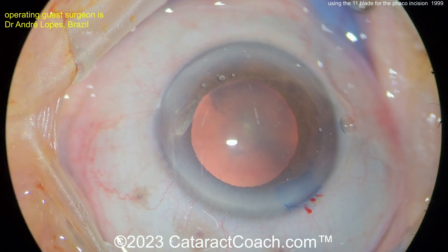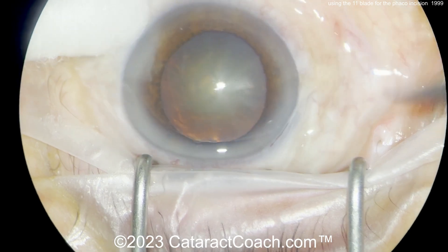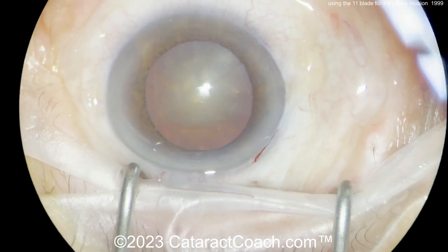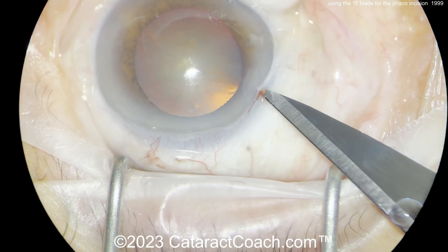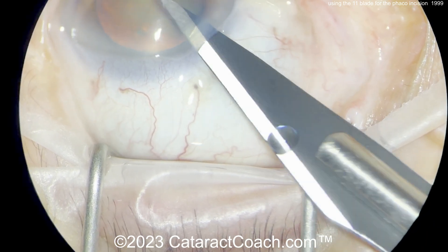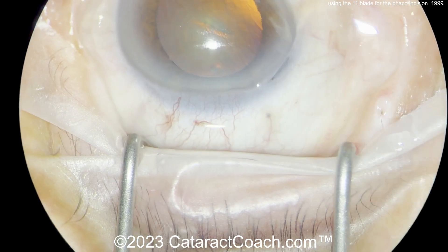Let's watch this again — here's another one. Again using the blade, a little bit of a groove being done right now. Now watch — this is the challenge, because remember the blade is very long. So when you make the incision as wide as you want with the right architecture, you may have the tip of the blade going very far into the anterior chamber. You're going to be very cautious. There it is, and now the incision is widened up a little bit.